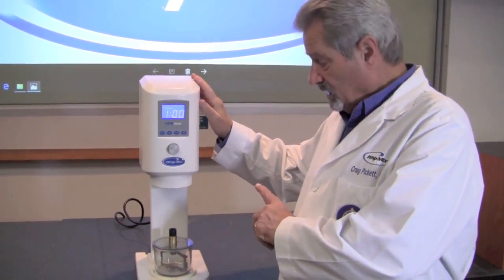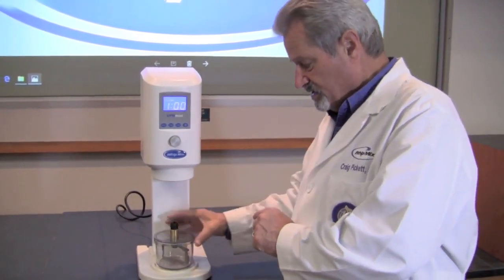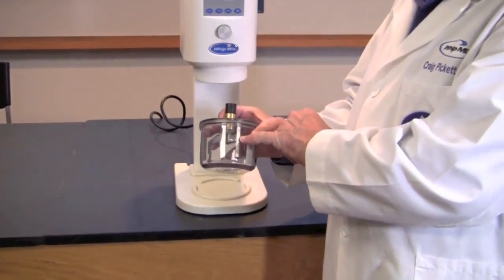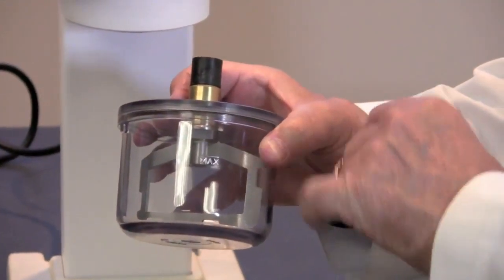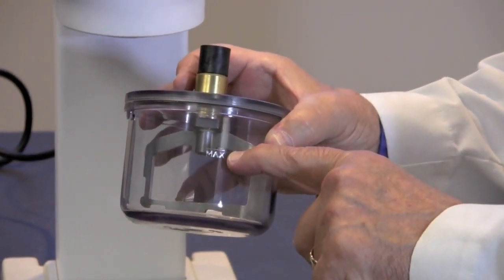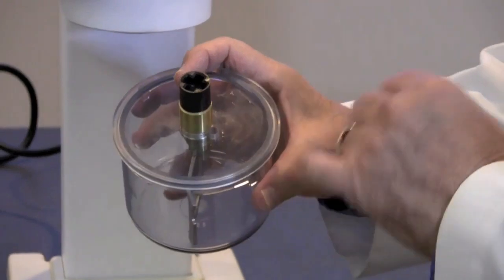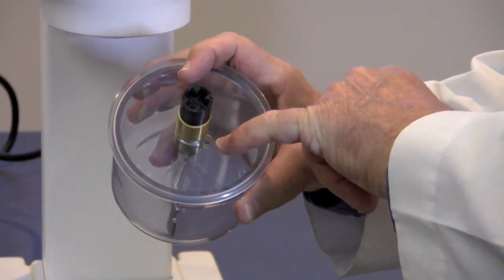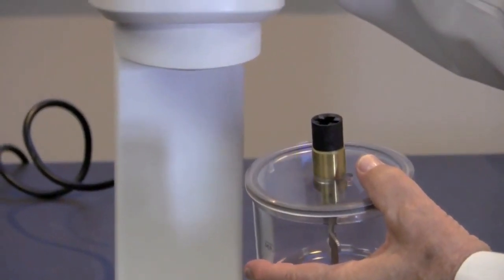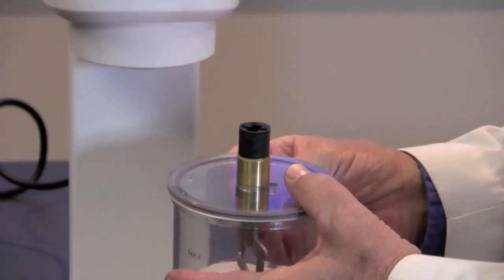Now with the VPM Mini, there are some things we need to be concerned about. Technicians often will disregard something called a max fill line, which is on each of the bowls that comes with the Mini. The powder element should be filled only to the max fill line. If you fill it beyond that, you run the risk of the vacuum pulling either powder or liquid material through the vacuum hole in the lid and into your machine, causing problems with your vacuum. Make sure you don't overfill this bowl.